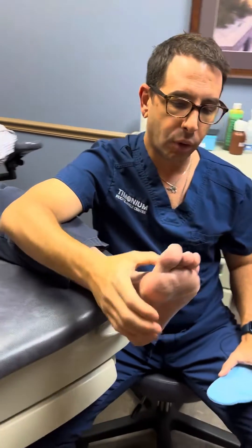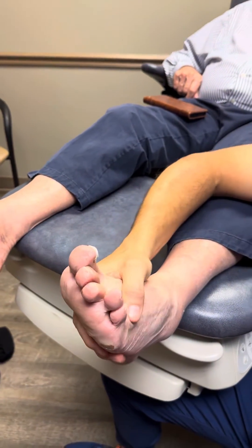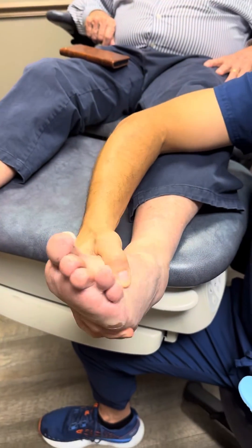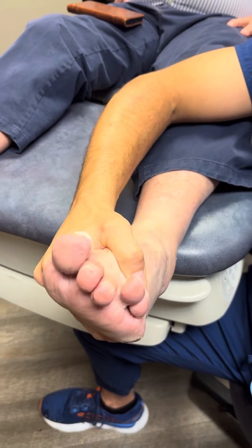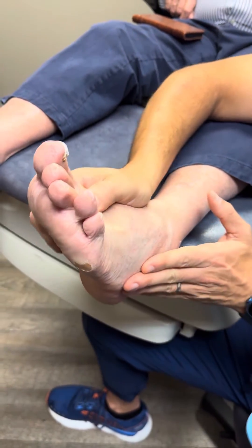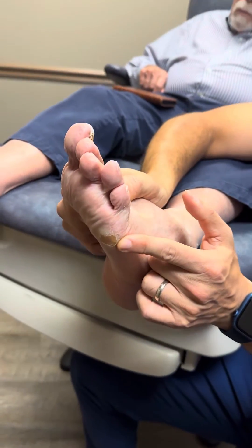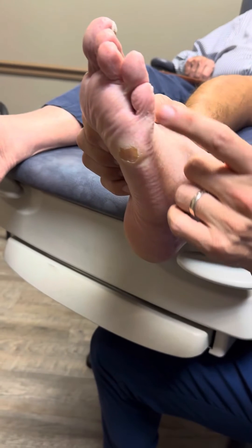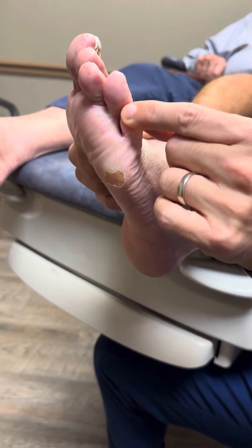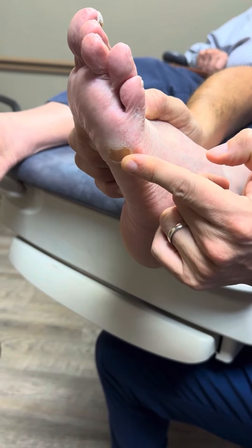If we come around to his ankle here, he has what we call a fairly fixed ankle deformity, which means his ankle is more or less stuck in this kind of curved position. There's very minimal movement of his ankle, so his heel sits inverted. What's happening is he was having a tremendous amount of pain right here — basically his fifth toe is pushing his metatarsal bone into the ground, and this is causing an extremely painful callus.